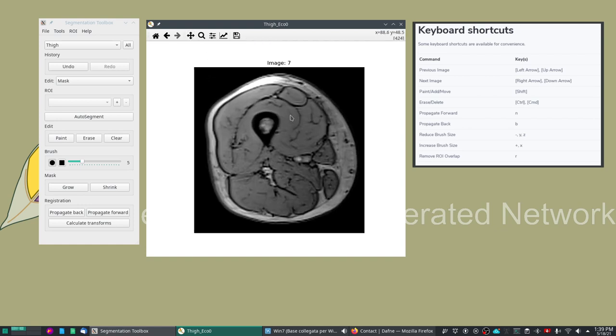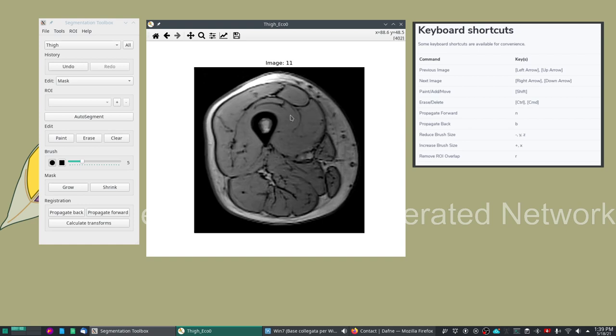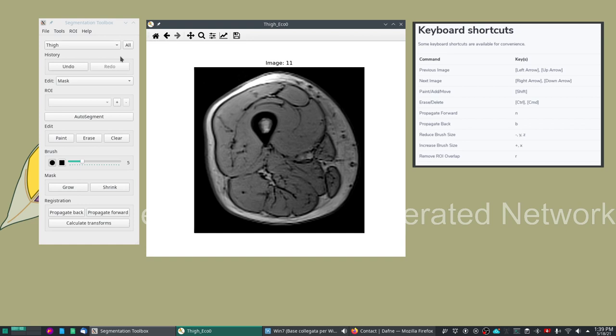So we shouldn't forget to remove the tool that we are using so that we can actually edit the image. Let's take one middle slice where we can see some nice features and start showing the features for manual segmentation that Daphne offers. Manual segmentation will work completely standalone and you will not need any API key.